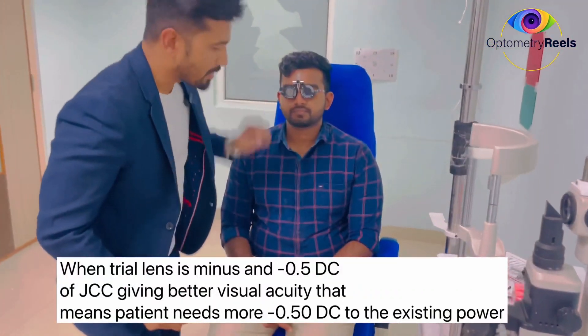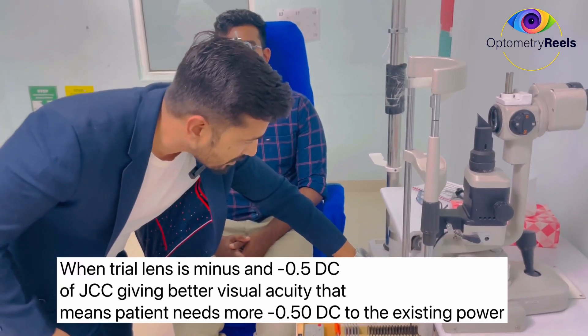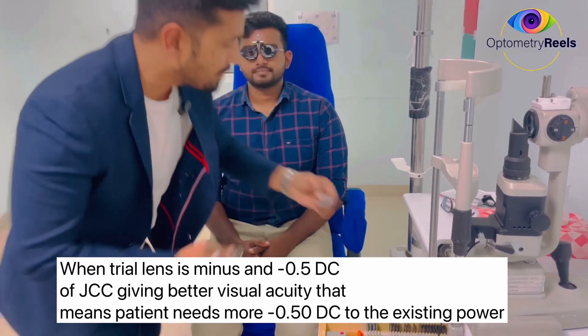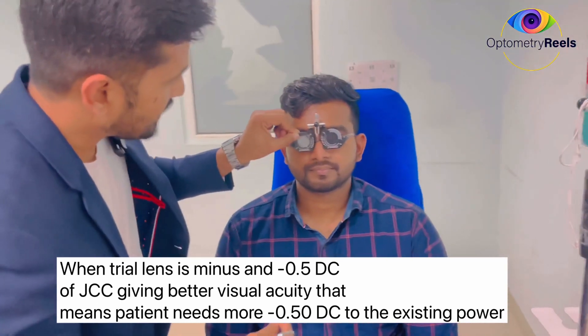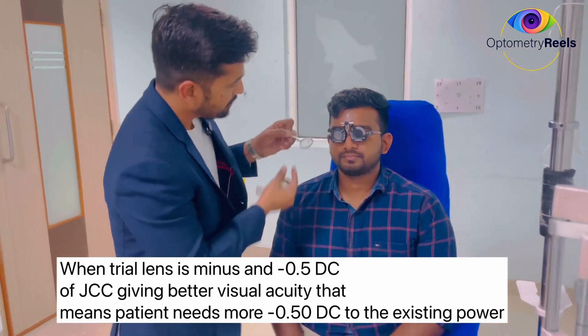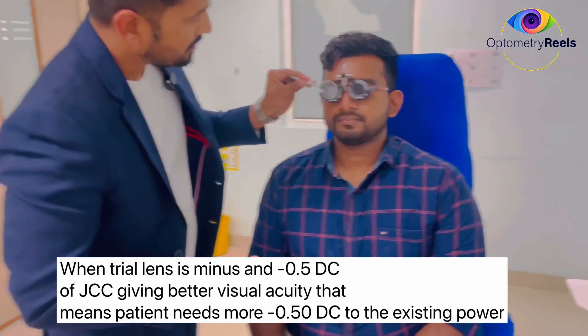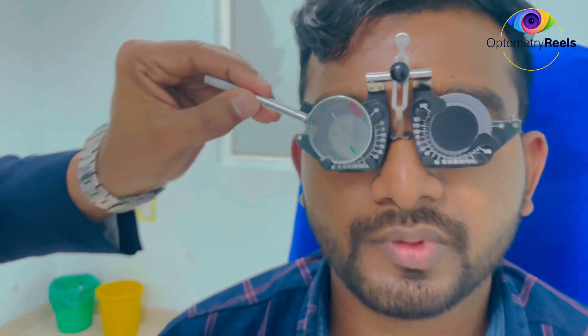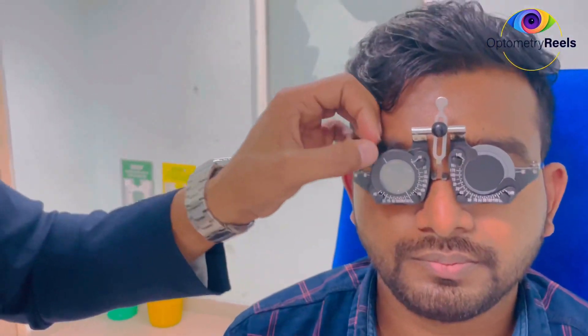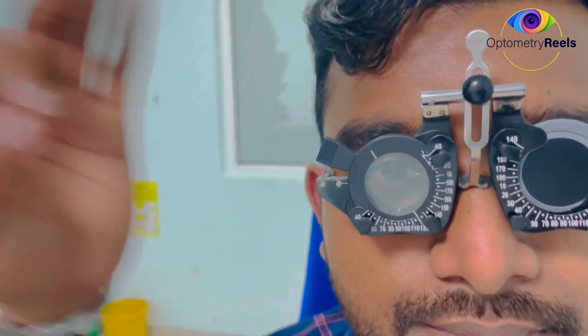So we have to add 0.5 to the cylinder. The cylinder was 1.75, so adding 0.5 makes it 2.25 at the same 120 axis. We ask the same question again — this or this? Both are the same. Then asking once more — this or this? The patient says this is better. So minus 2.25 at 120 axis is the actual cylindrical value.